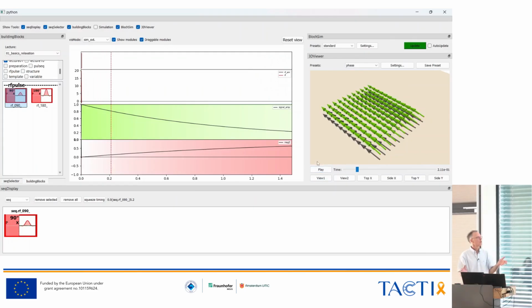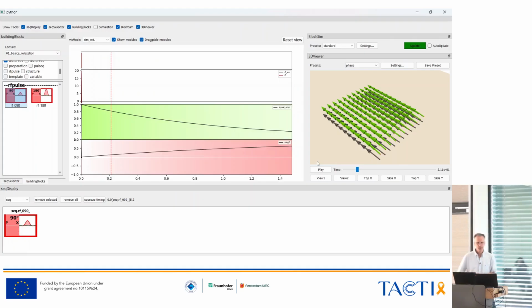And of course, you could say, okay, but why is the phase always pointing to the same direction? Didn't we say that our magnetization is precessing all the time? And of course, we could do it, but then it would start to spin. If we would be realistic, it would spin 128 million times per second. It's a little bit fast, so there is an easier way how we actually look at such images.